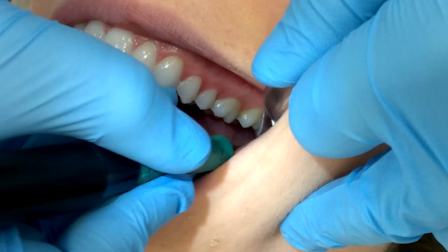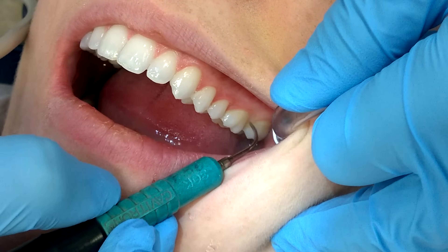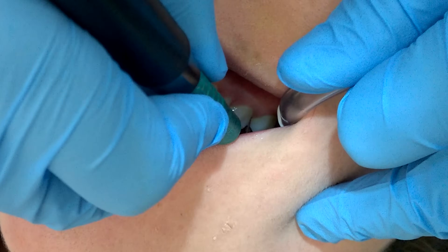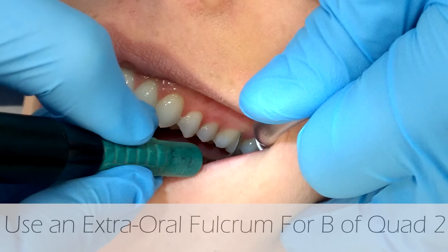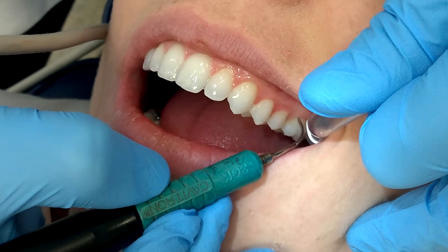If it is tender to the patient, consider just skipping that area with the ultrasonic and hand instrumenting it instead, or consider getting it numb if you do need to get into the area to remove the calculus.